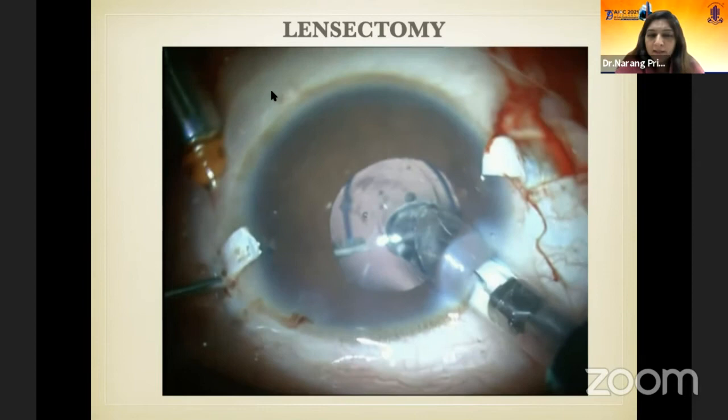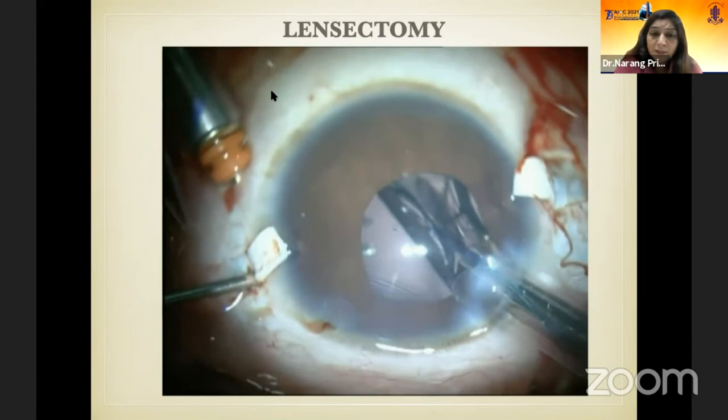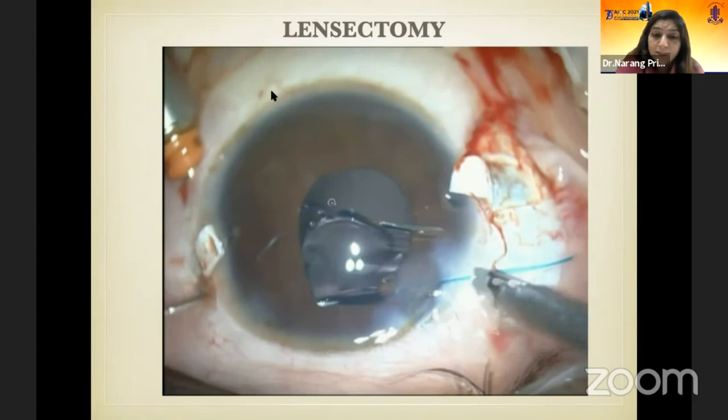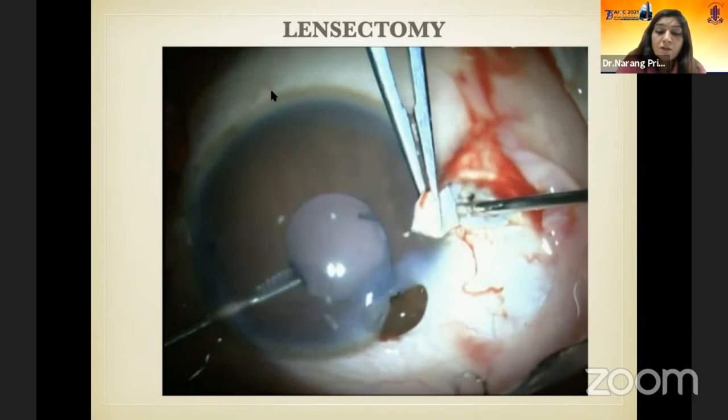Because what happens when you have a big eye, you're trying to come anterior and you might pull off the peripheral iris tissue. So in order to prevent that, peripheral iridectomy is done. This is a very clinically important point, which should be taken into consideration. What I want you all to appreciate is, although the haptics are being externalized, the fluid infusion is continuously on. This is very important, which I see missing in many surgeons doing secondary IOL fixation procedures.